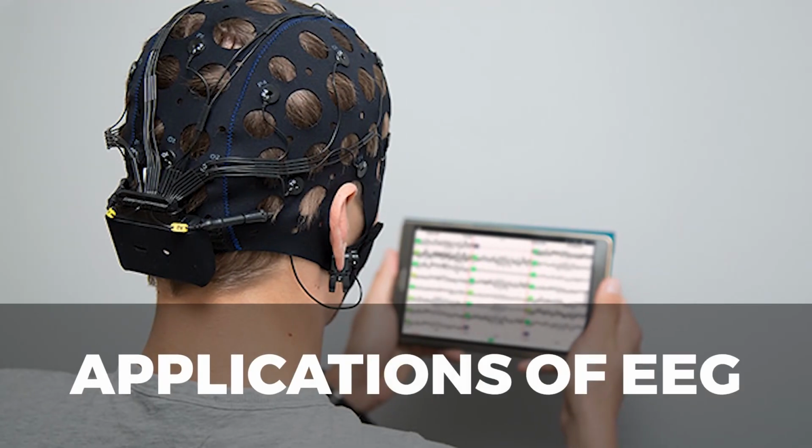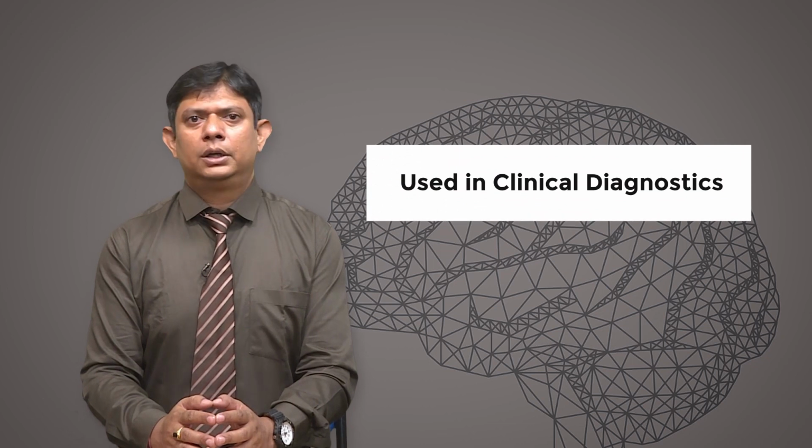Now, let us discuss the various applications of the EEG. Certainly, the EEG has a wide range of applications in the biomedical field. Here are some of the key applications. In clinical diagnostics, EEG is a primary tool for diagnosing and monitoring epilepsy. EEG is essential for diagnosing various sleep disorders. It tracks sleep stages, breathing patterns and disruptions in the sleep cycle.